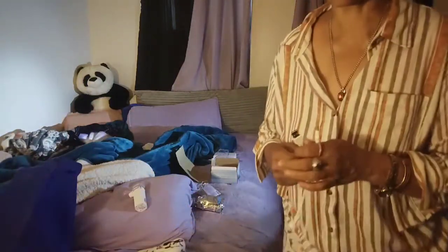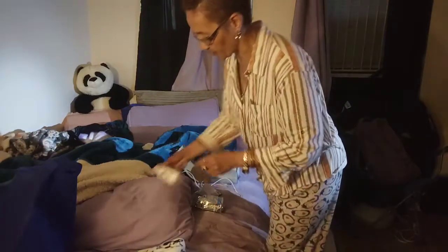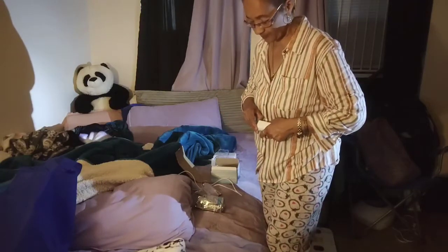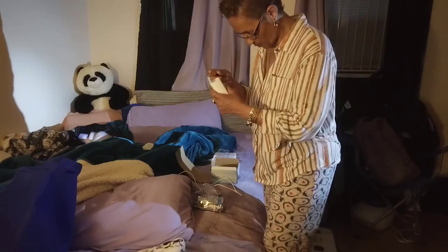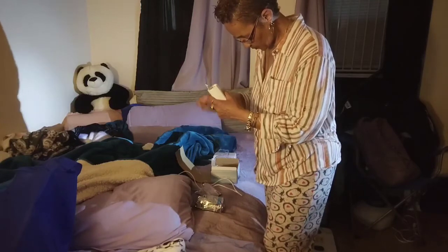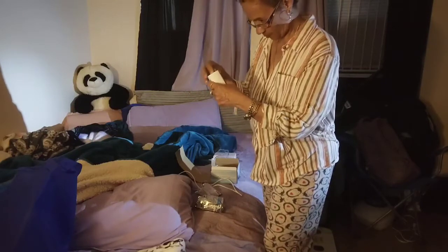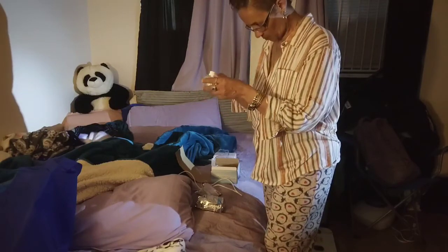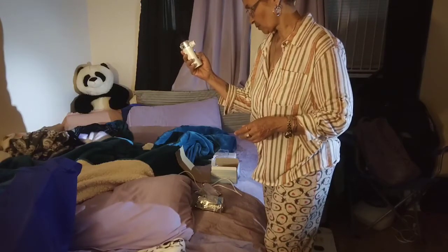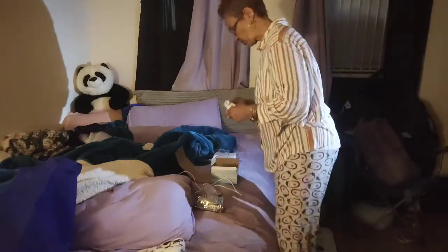That way I know the force of it. Well, I'll tell you if the batteries are bad or not. I want to do the batteries. I can tell if the batteries are bad or not. So I have to go back over there. Okay, so it's 2 AA batteries, and it tells you positive and negative, one up, one down. It tells you right on the lid. Okay, let's see. Okay, the batteries are good. That's a good sign.